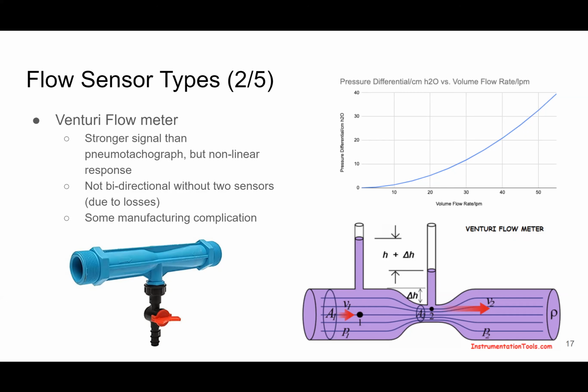Those were similarly sized venturis. And then in the bottom left is a picture of a gardening venturi that we'd used on a different project, which, at least to a first order, is sized almost exactly right for what we're trying to do here. We have used a 3D printed part, but the nice thing is these are cheap injection molded $4 parts if that ended up being the right sizing. Next slide.